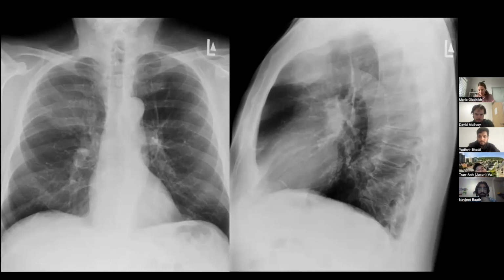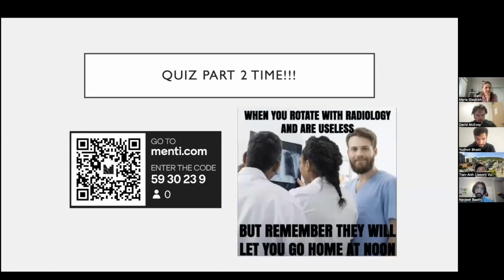overnight, for example, on internal, if a patient comes in and you get a chest X-ray done, the number one thing you have to be able to say overnight is, out of the things that could kill you, is there a pneumo? Things that will change your management right away. Is there a pneumo? Is there a pneumonia? And that's pretty much it, right? The other things you probably want to get more imaging on anyways. Okay. All right. And this is just to hone down what I went through with localizations.